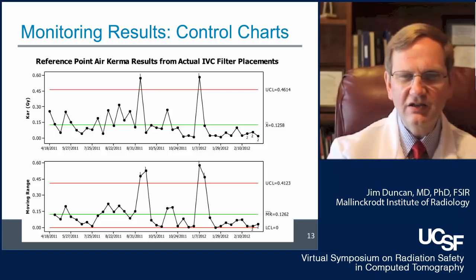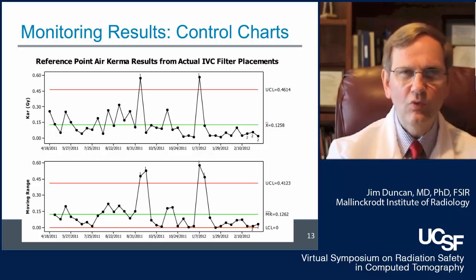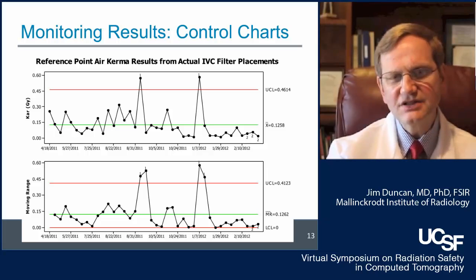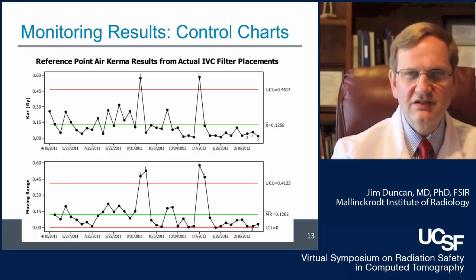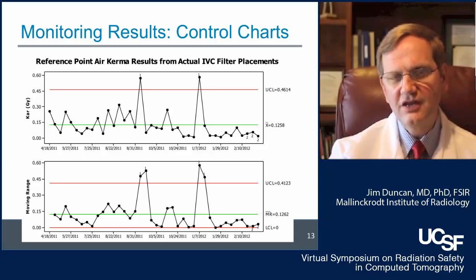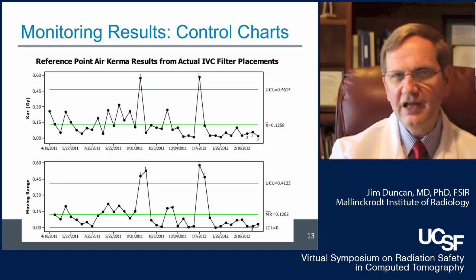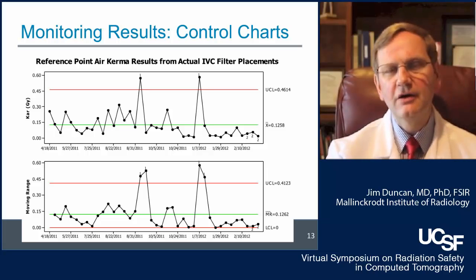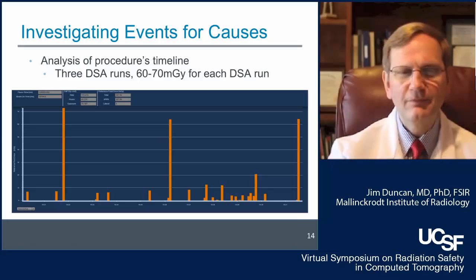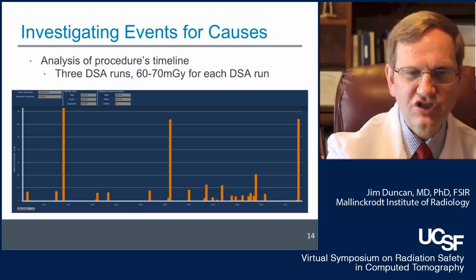The software has highlighted the 2 cases above the red line with a numeral 1 as one type of unexpected event, and then there's a series at the very end of 2s which are below the green line, which says that it's unusual to expect a series of cases to lie underneath the average like this. And this was an indication that when we changed our protocols back in September 2011, we actually dropped our expected dose for the average and need to recalculate based on that expected change.